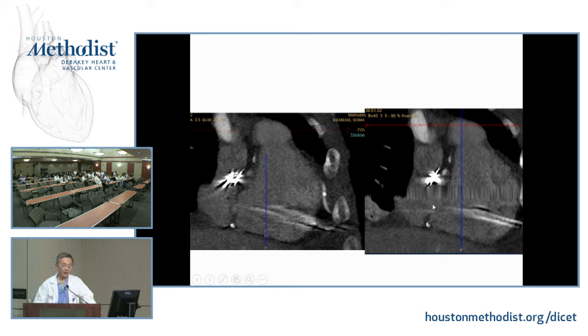So what happened is this patient has a slightly irregular heartbeat. The technician thought it was a PVC, so he decided to take out the sets of data corresponding to that beat, okay? And since the patient's heart rate wasn't that fast, that leads to the loss of the data, okay? So anyway, in a study you can find a lot of these artifacts.